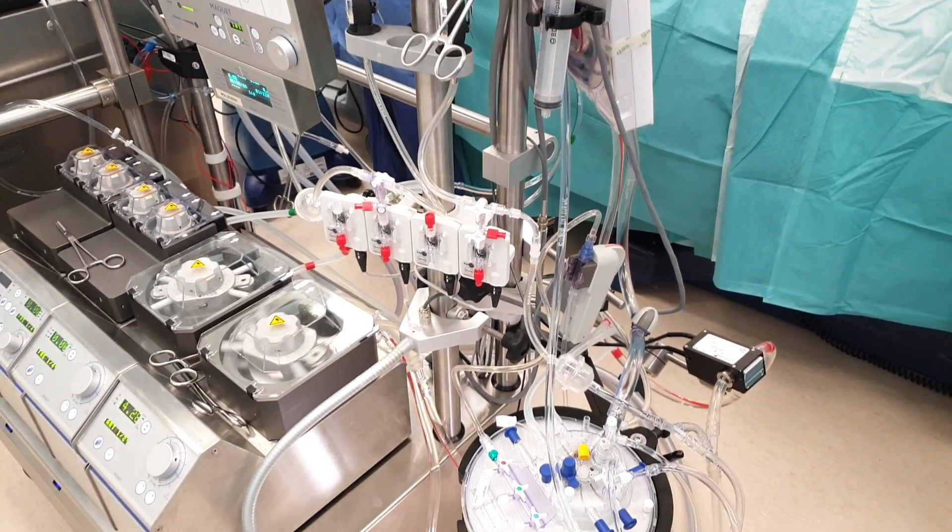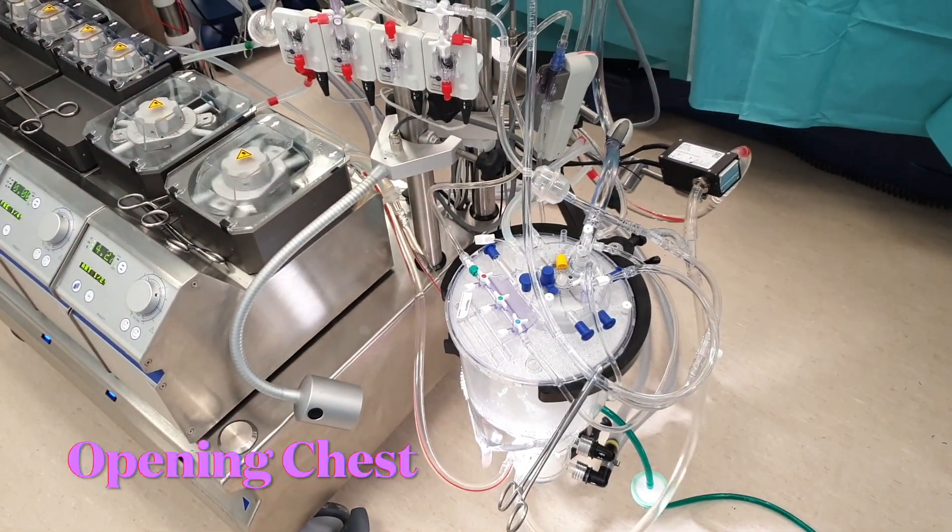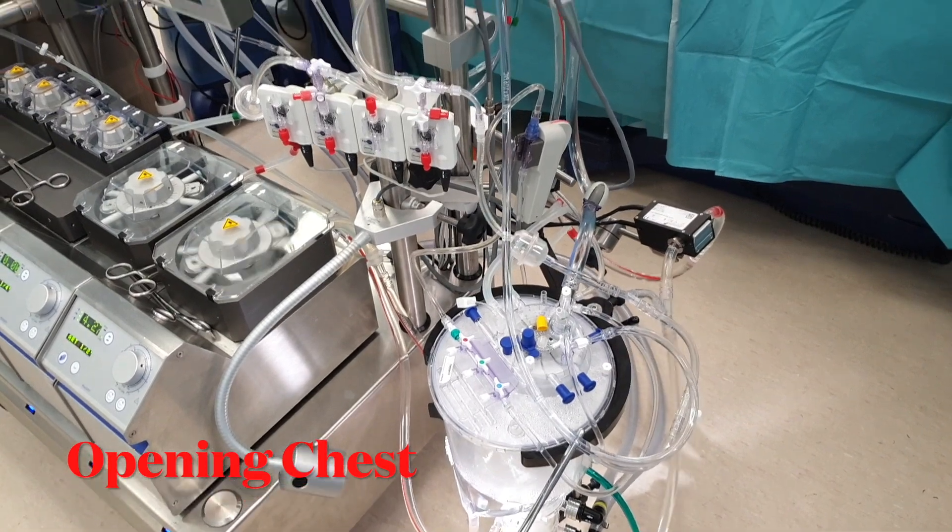In this video we are going to see how we put the patients on to cardiopulmonary bypass. Our job is to keep the patient's heart and lung function normal while the surgeon is operating on the heart.